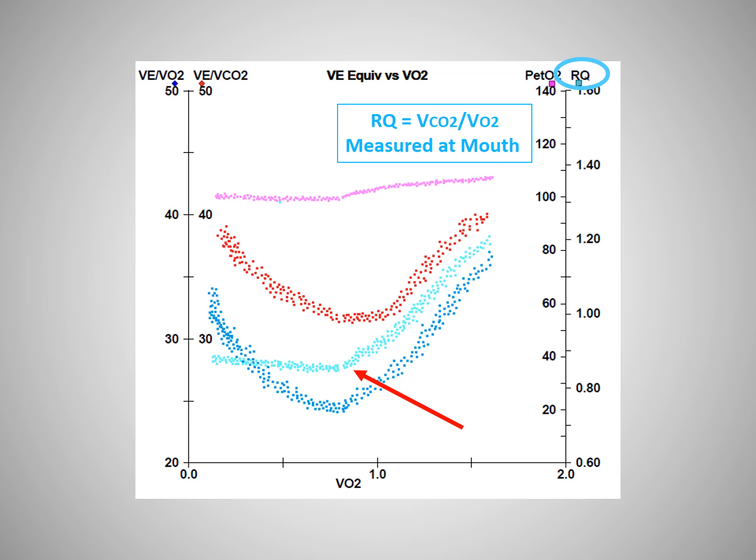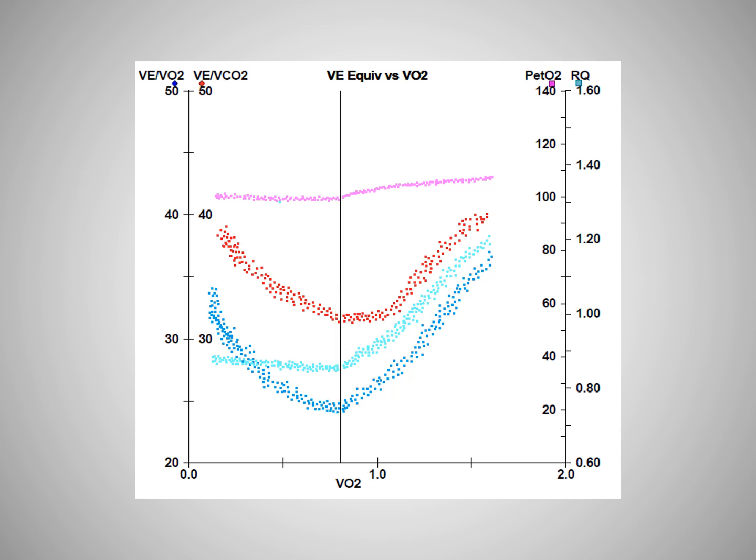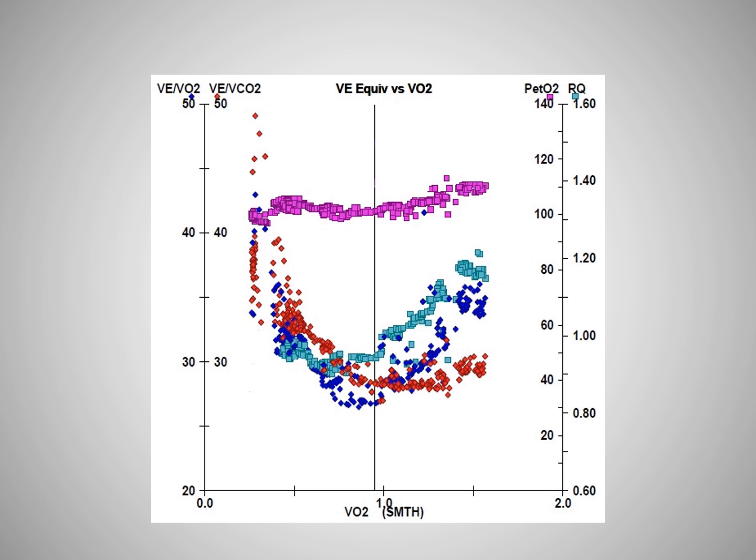Well, as we would expect, when we cross the anaerobic threshold during exercise and start buffering lactate, the ratio of VCO2 to VO2 starts to also rise rapidly. If you can draw a line that goes through all of these points that we have just identified, you can feel fairly comfortable that you have identified AT correctly. Now I'm going to show you a couple of actual patient tracings.